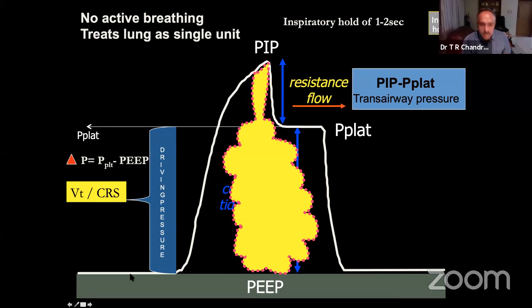So when you see a graph like this, you are not seeing lines. That is my point. You are looking at airways and alveoli. So if somebody asks you, are you seeing some alveoli and airway? You should say, yes, I can see my patient's airway and alveoli through my graphs. That is what I want to impress upon you and make you understand. There is so much information you can get, so that you know whether the problem is airway or the problem is alveoli.